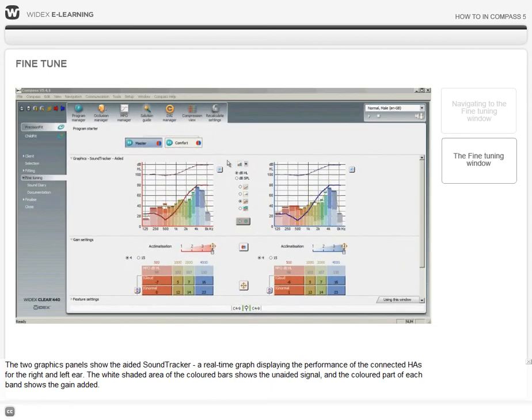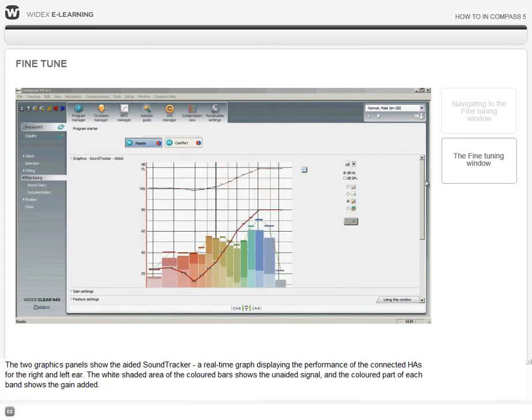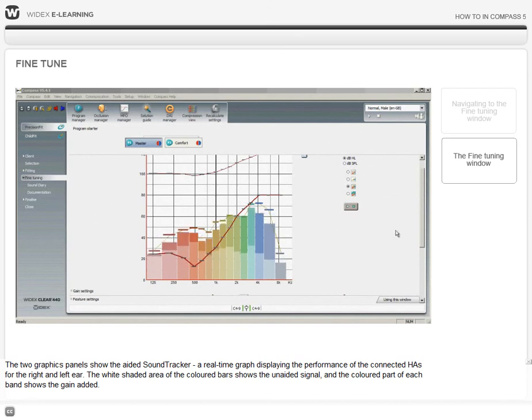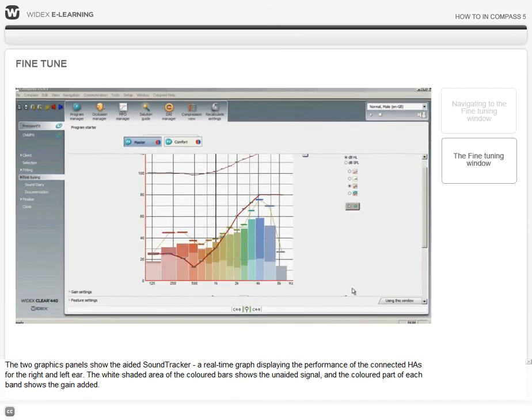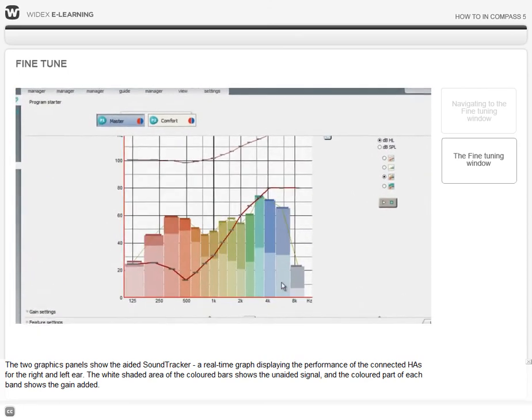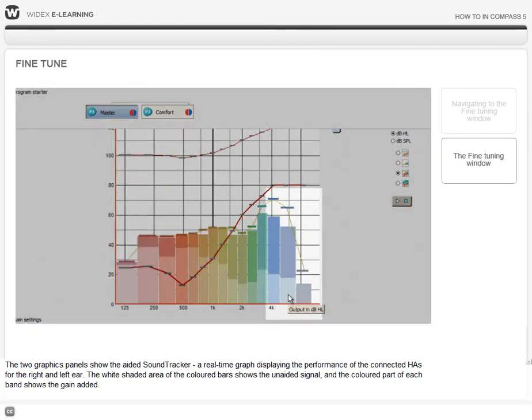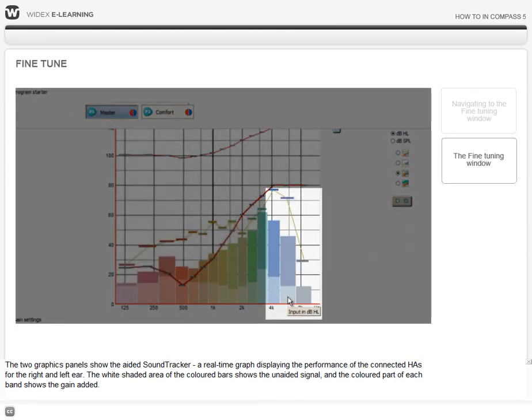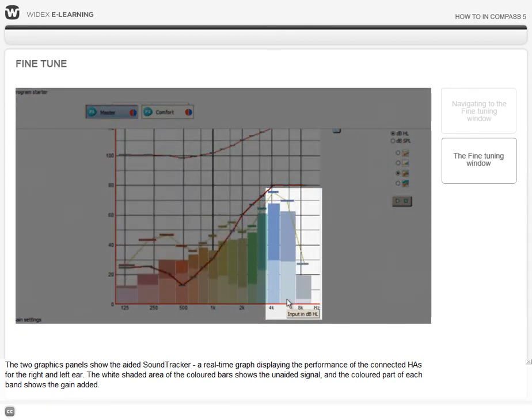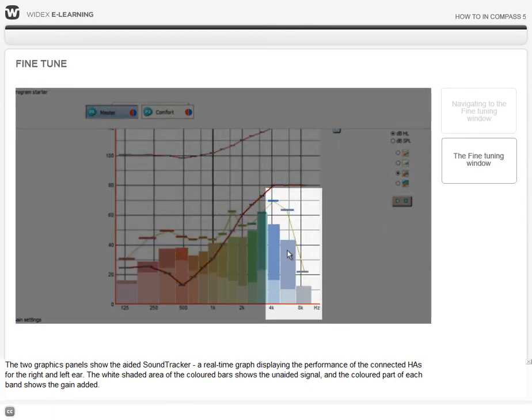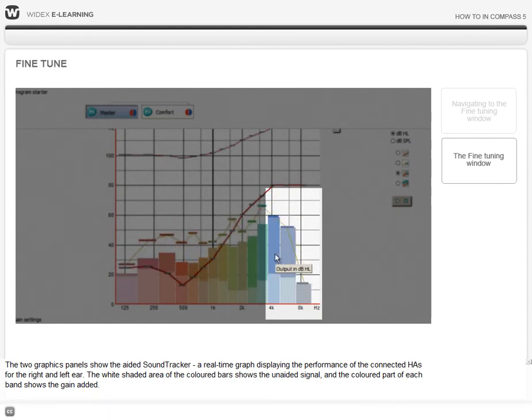The two graphics panels show the aided sound tracker, a real-time graph displaying the performance of the connected hearing aids for the right and left ear. The white shaded area of the colored bars shows the unaided signal and the colored bars of each band show the gain added.